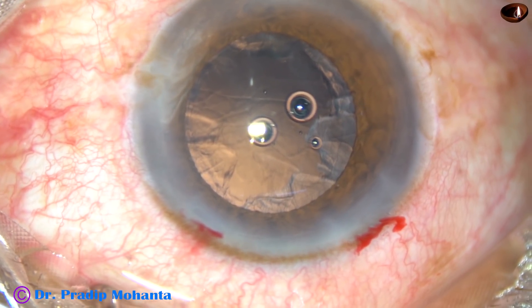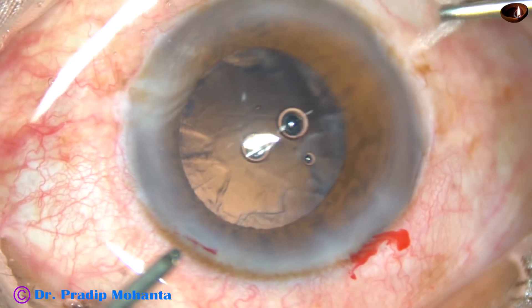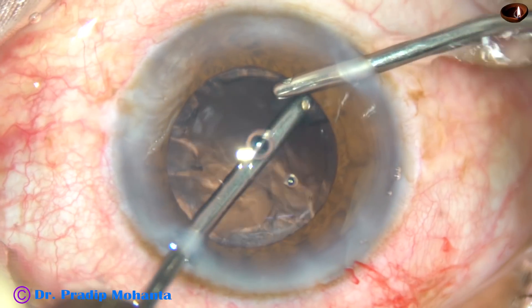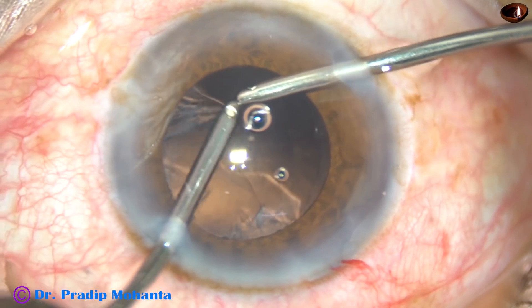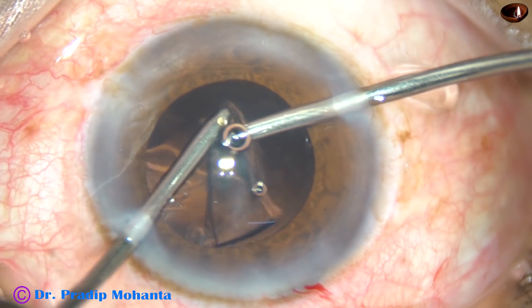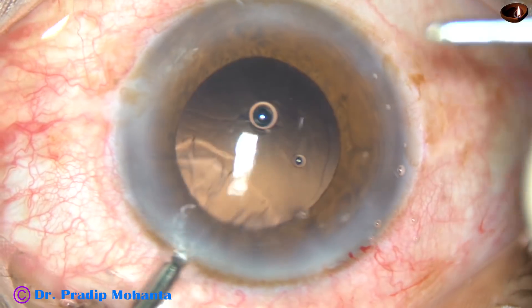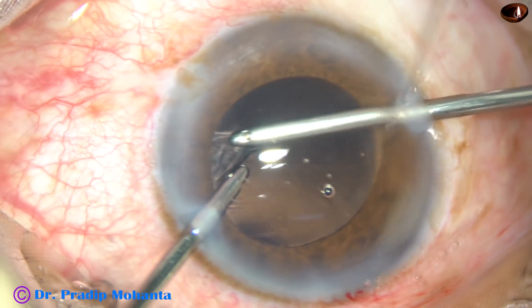Viscoelastic substance has been injected into the anterior chamber. Now bimanual irrigation-aspiration is being used to remove the cortical matter. The irrigation is from the right side port, and the aspirating probe is removing the cortex from 4 o'clock to 1 o'clock. I then change hands and remove cortex from 1 o'clock to 4 o'clock.